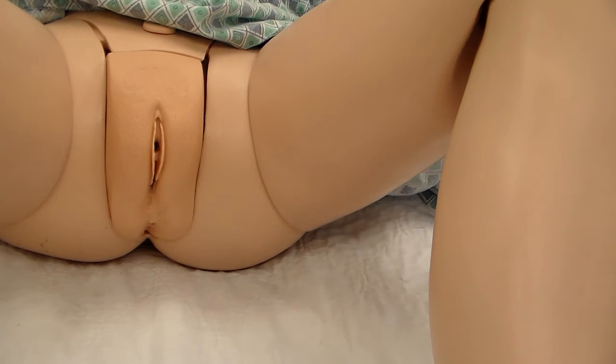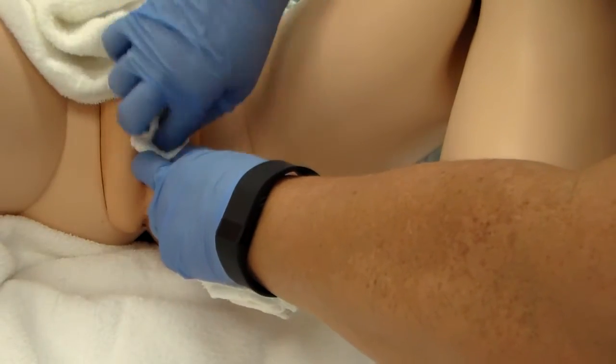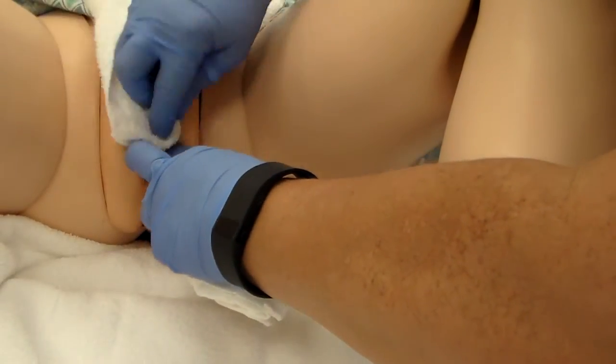And then what am I going to do? I am going to wash and dry the perineal area, okay? So you're going to have, oh, I forgot about the basins. So you want a soapy washcloth, a rinse washcloth, okay, and a towel. Okay, you can put the towel down underneath the perineum. You're going to wash, okay? You learned this already, from inside to outside, and then you're going to go the different four corners, right? Okay, and then you're going to rinse it the same. Okay, rinse it good, and then you're going to pat it dry.